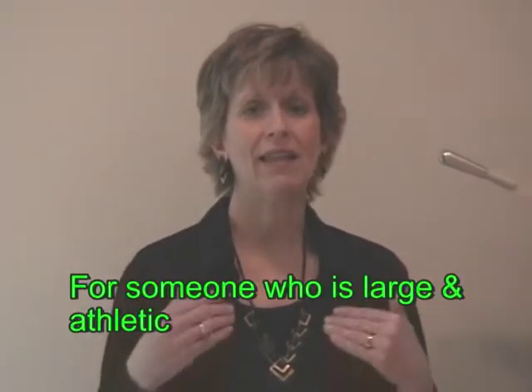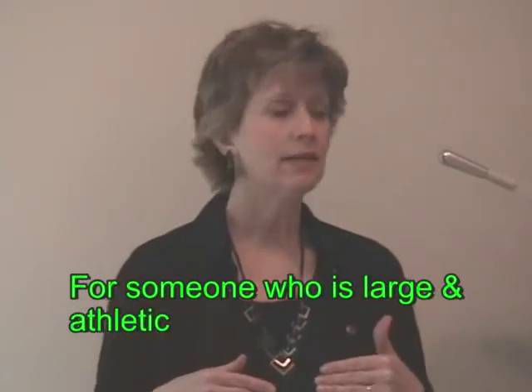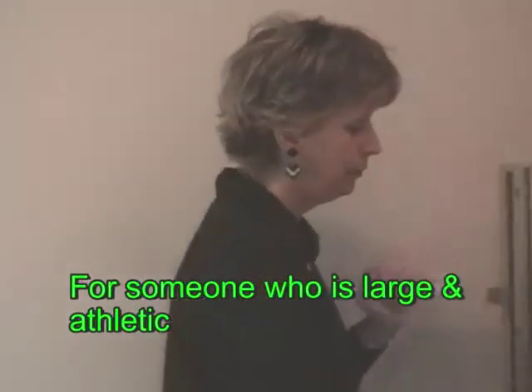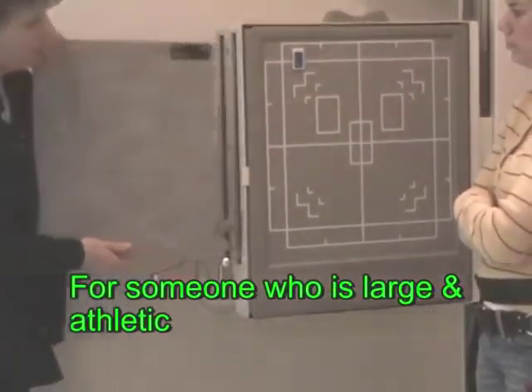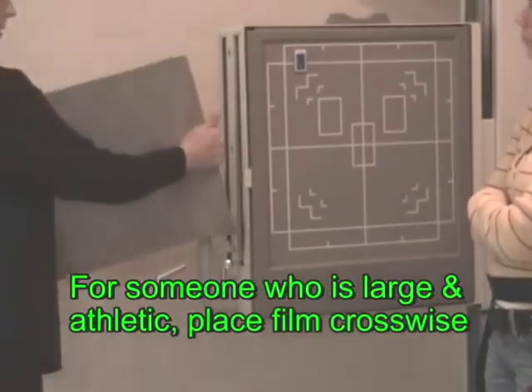They're tall, they're wide, they're fit. When they take in a deep breath, their lungs will probably expand off of a 14 by 17 film. Somebody who is large and who is athletic, it may be necessary for you to place the film crosswise. Okay?